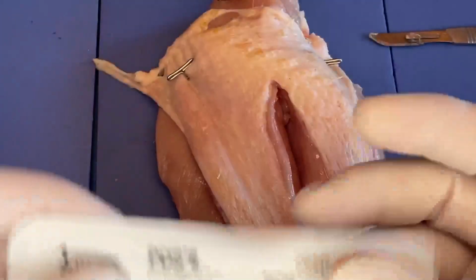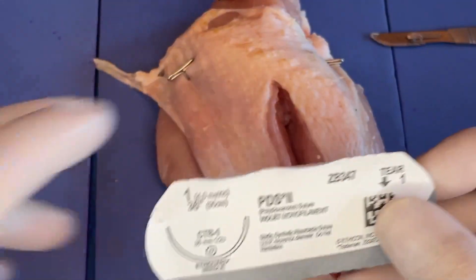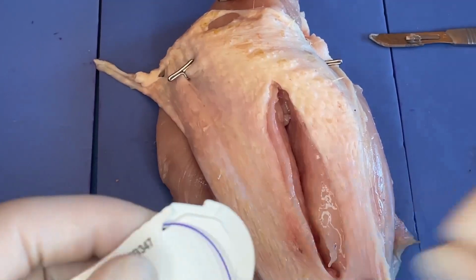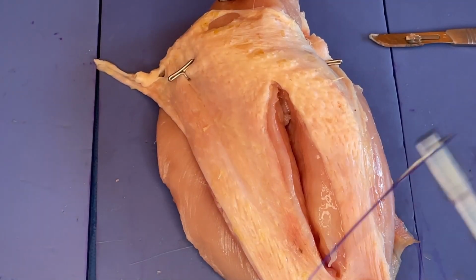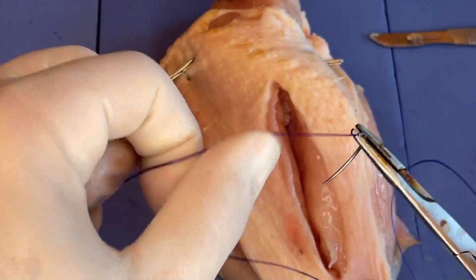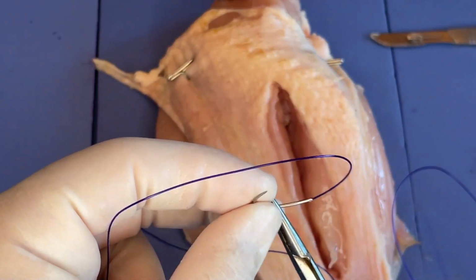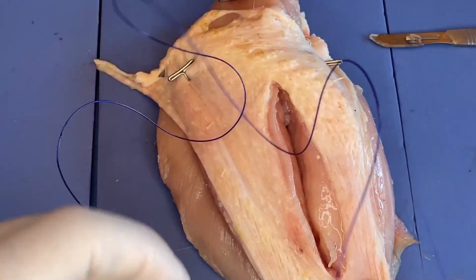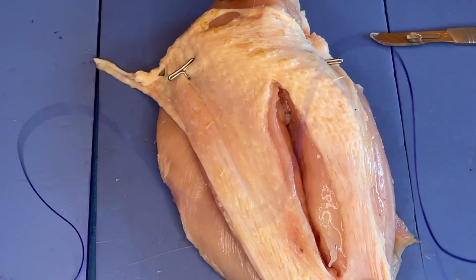So we're going to use the CT1 equivalent here just because it's going to be a little bit easier, but I just want to show you the size and kind of heftiness of this stuff. And again, this is what I use to close fascia. So a nice heavy suture. It's a monofilament. You can see that it tends to really bunch up, and it has all of its little curls in it. So it has a long memory.